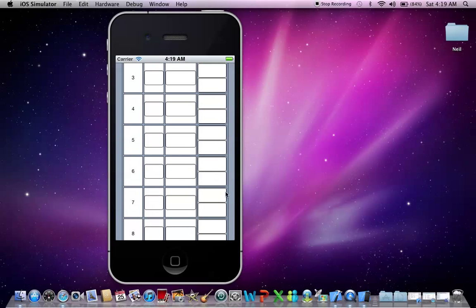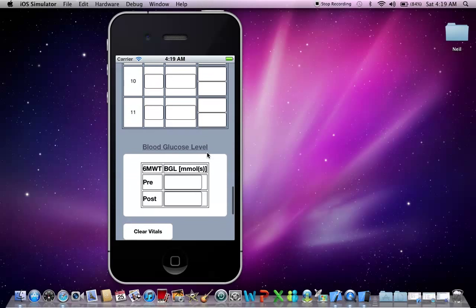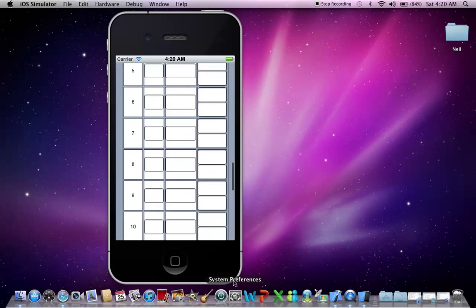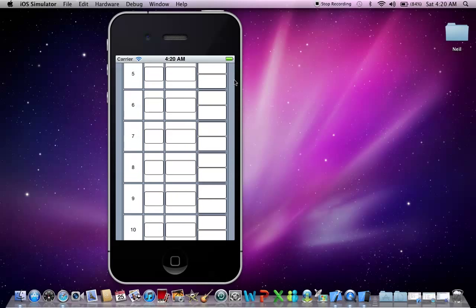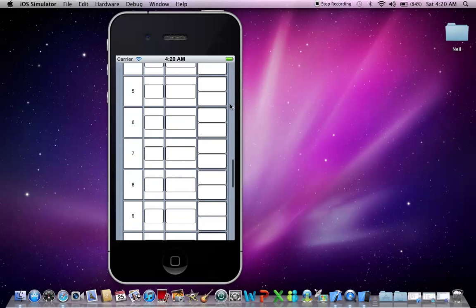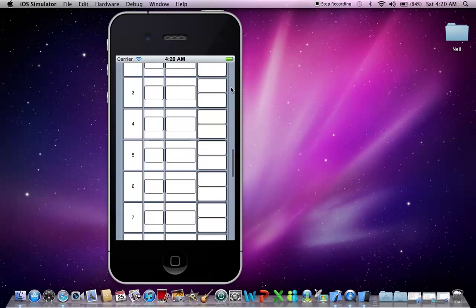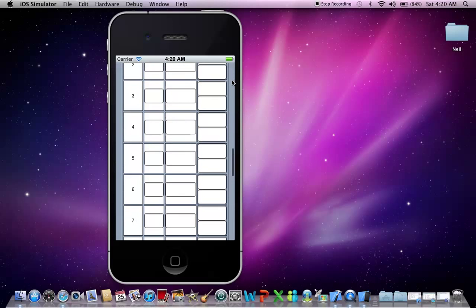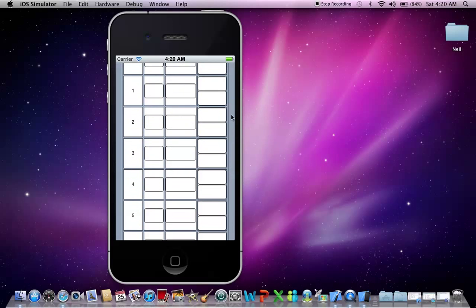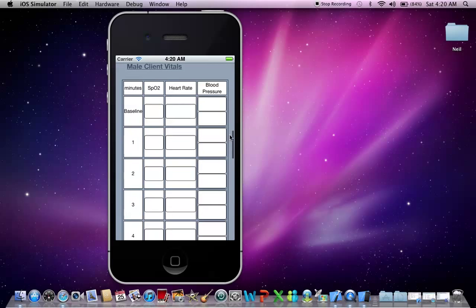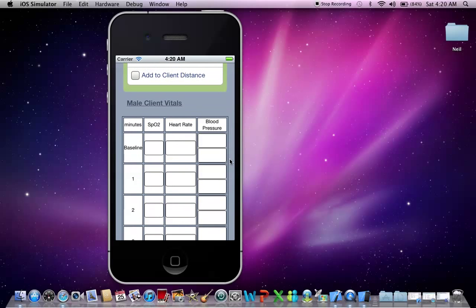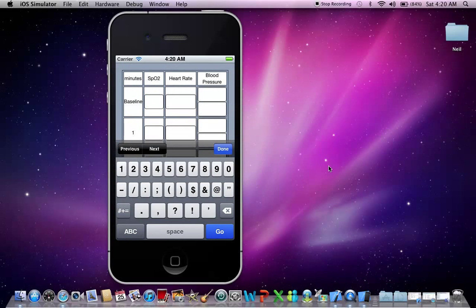So let's just scroll down there. Here it is there. Okay, so usually when you would start, well before you start a six minute walk test, you would have your baseline observations, which includes heart rate, sats, blood pressure and blood sugars. So let's put those in.